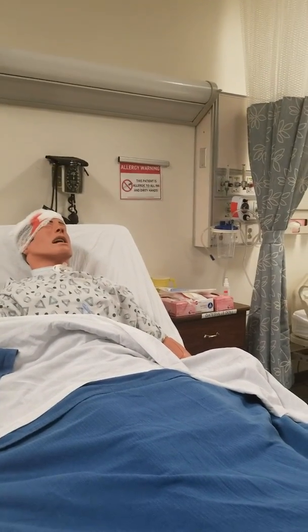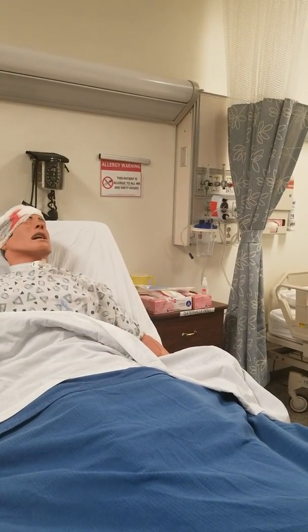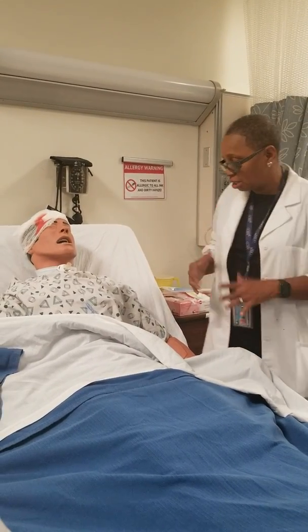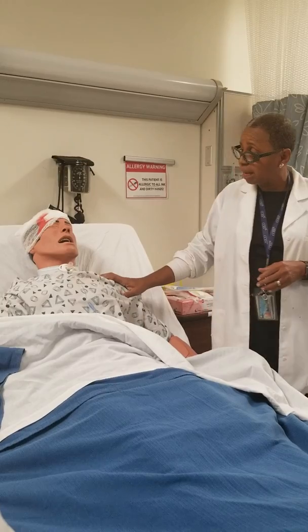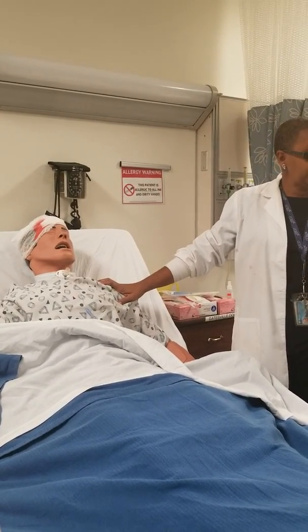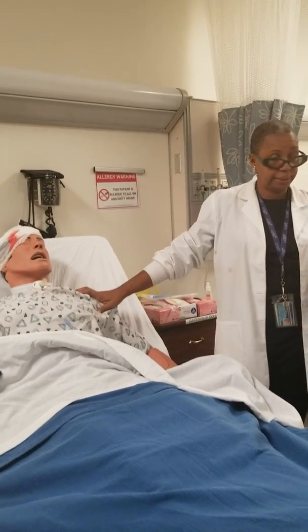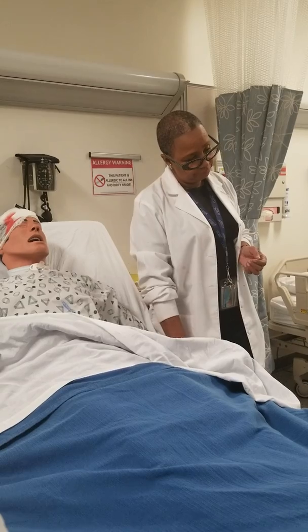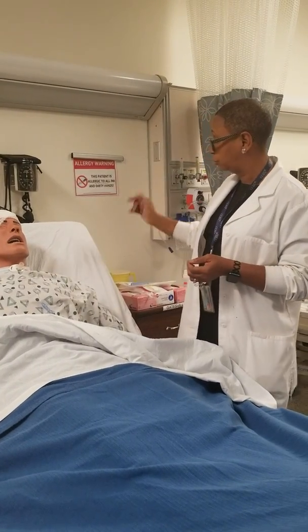Okay, so let's go ahead on with the skill itself. The first thing I'm going to do is come in and introduce myself. Hi, Mr. Jones. My name is Kathy. I'm your student nurse. Any type of pain? I can see if he can follow commands. Can he nod his head? I'm trying to see how best to communicate with him. I check his name, two patient identifiers, right? And I wash my hands too.